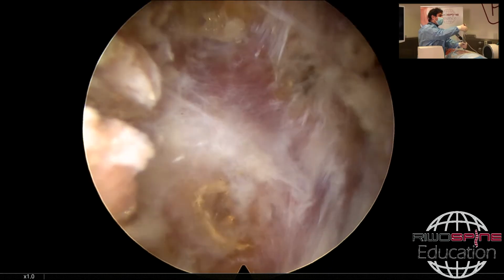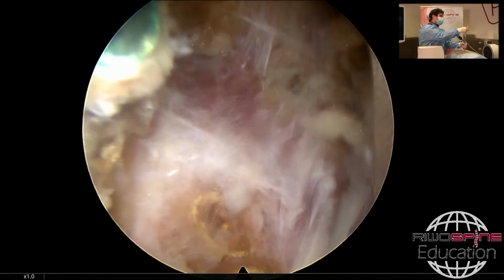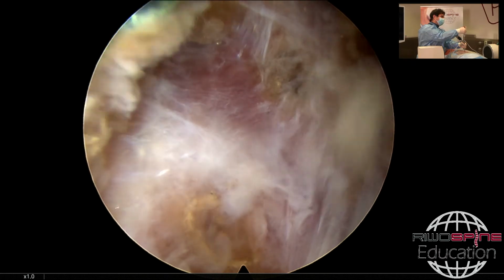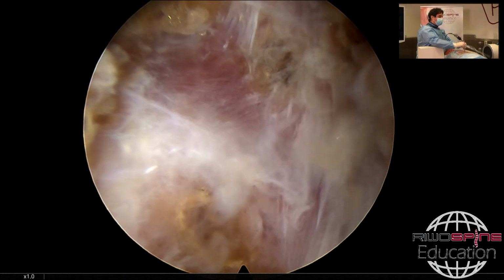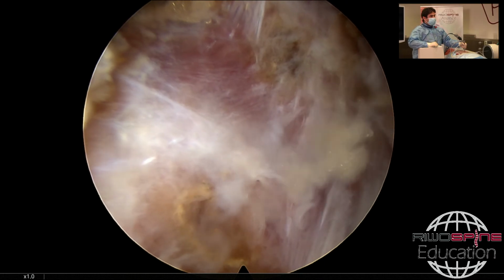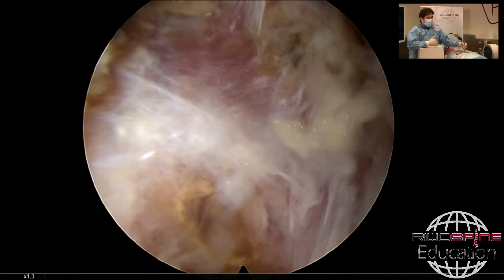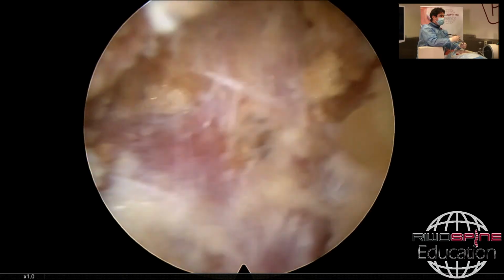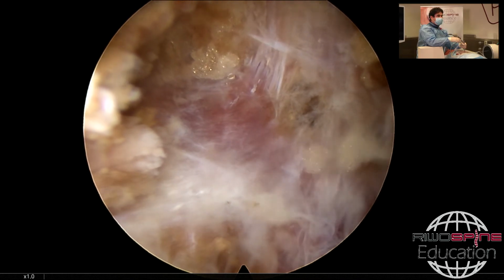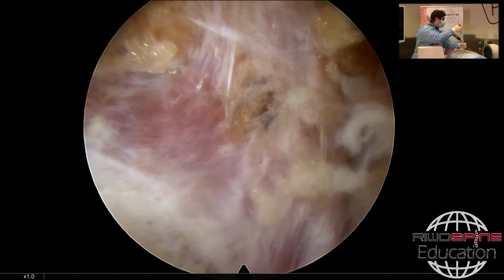Okay, first of all, basically, especially for the far caudal migrated disc herniations, there's a possibility that mostly the herniations are located in the axilla of the level, and we have two options. If it is really fresh, you can try to catch them from the shoulder, but the best way is to explore the axilla and remove it from the axilla first. Okay, let's check once again.